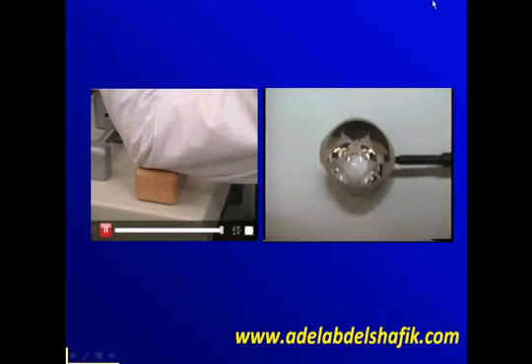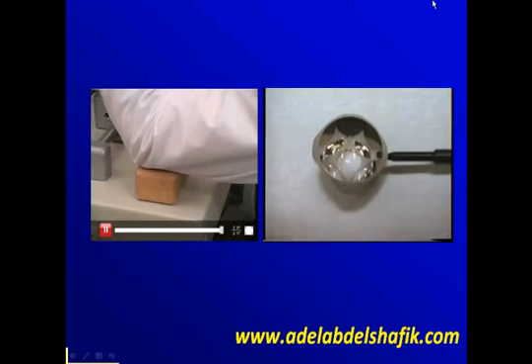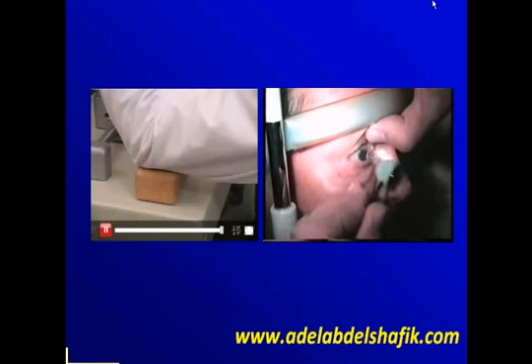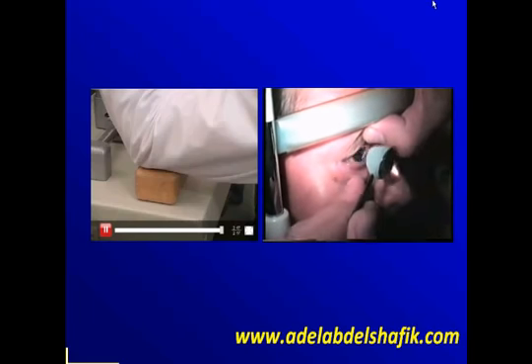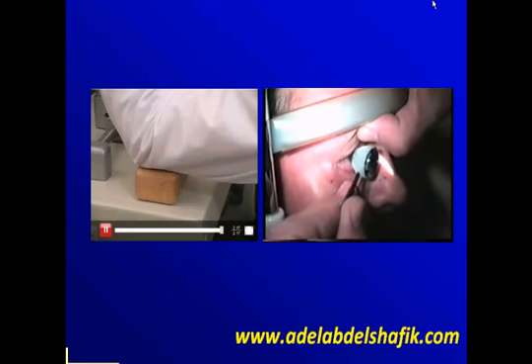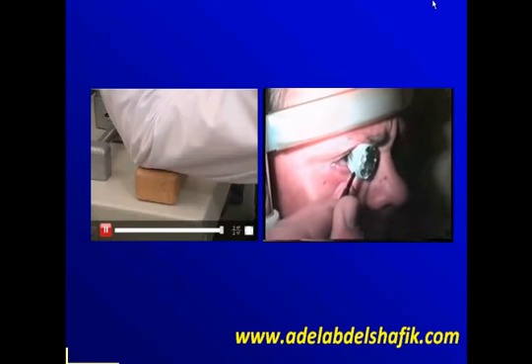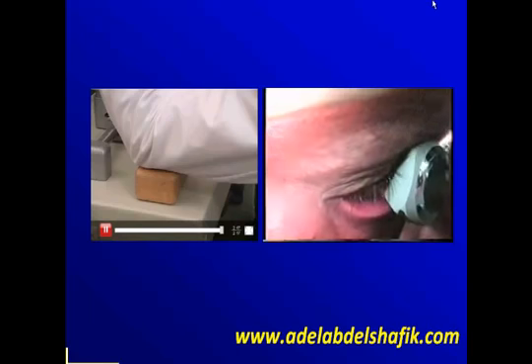And this is a small video of the Posner lens. It's a 4-mirror lens. You don't need any visco. You just apply it directly. You need a cooperative patient because the patient is free to move his eyes.